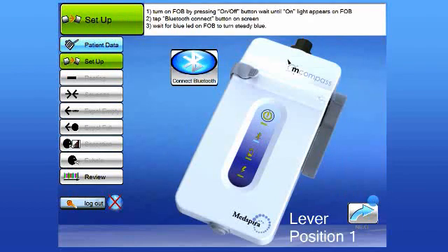This will bring you to the setup screen for the M-Compass Manometer, which is referred to as a FOB. It's the handheld manometer that is used in conjunction with the disposable catheter. It is wireless, so there are no direct connections to the tablet PC.